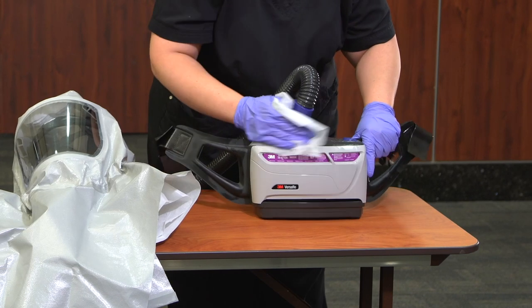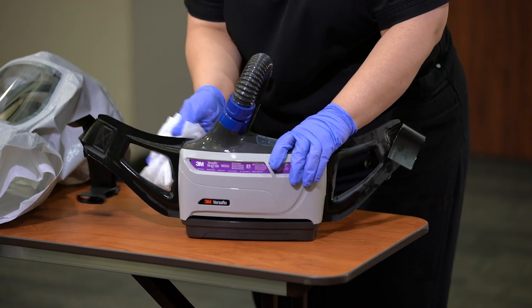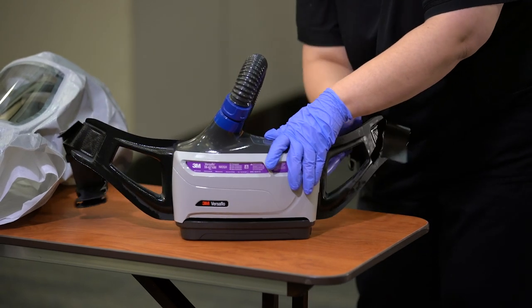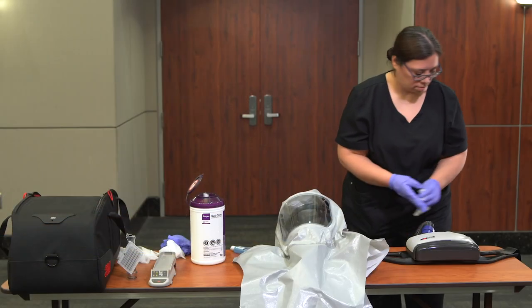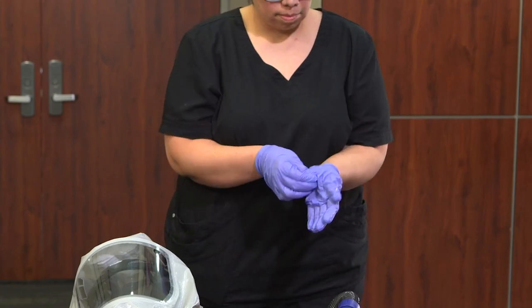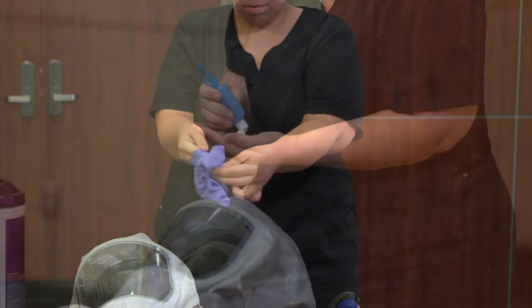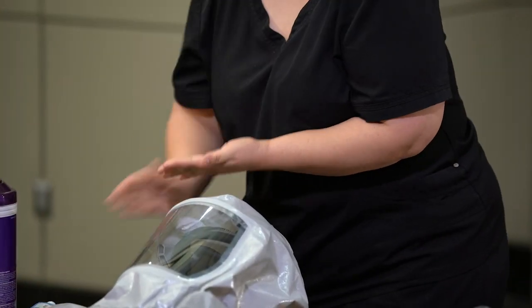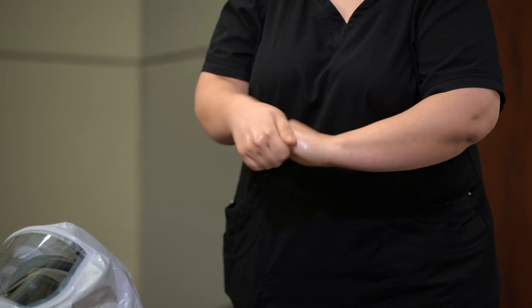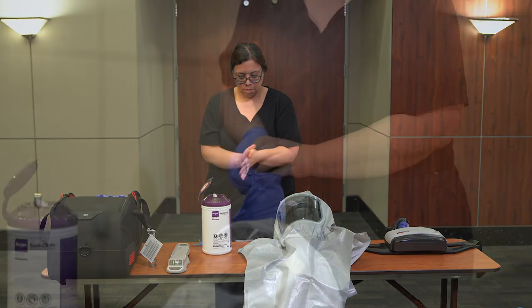Wipe the exterior of the blower assembly and blower assembly belt, then discard that wipe. Doff gloves using glove-to-glove, skin-to-skin technique. Perform hand hygiene. Don a new clean set of gloves.